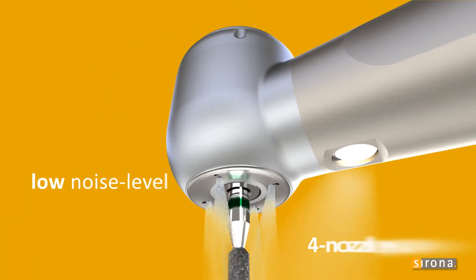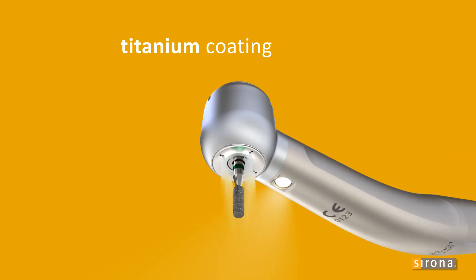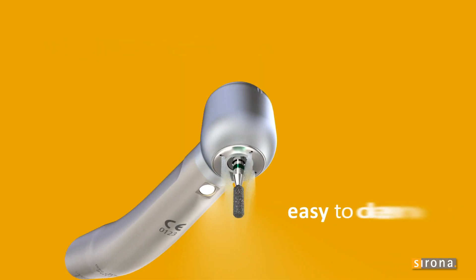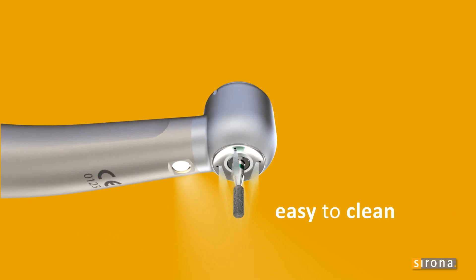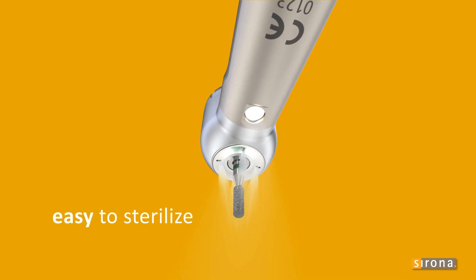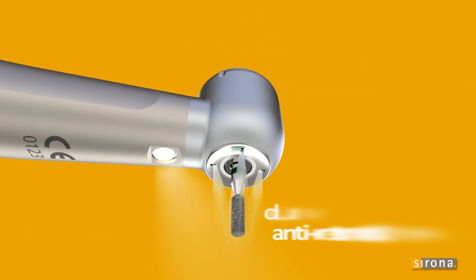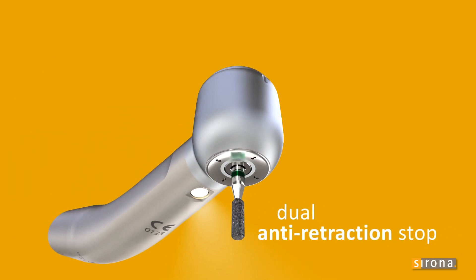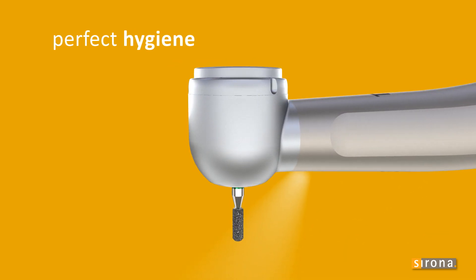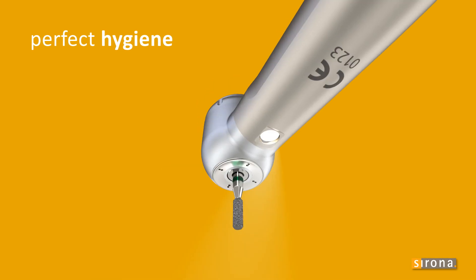The new four-nozzle spray ensures a consistently low noise level. The T2 turbine's titanium-coated sleeve is quick and easy to clean. High-grade materials and durable construction make the turbines thermo-disinfectable, as well as extremely resilient to the stresses of the sterilization process. The dual anti-retraction stop prevents contamination of the spray channels, making the T2 turbine the ultimate in hygiene and asepsis.